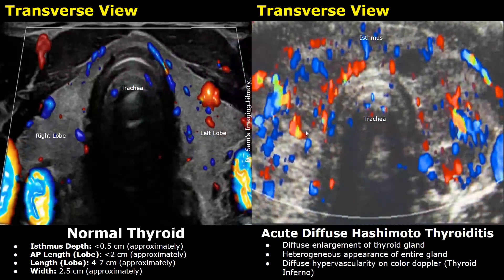This is a normal thyroid image with color Doppler applied. In normal cases, we will not see any significant vascularity within the thyroid — only a few Doppler signals are seen. In Hashimoto thyroiditis in acute stages, we will find diffuse hypervascularity on color Doppler.